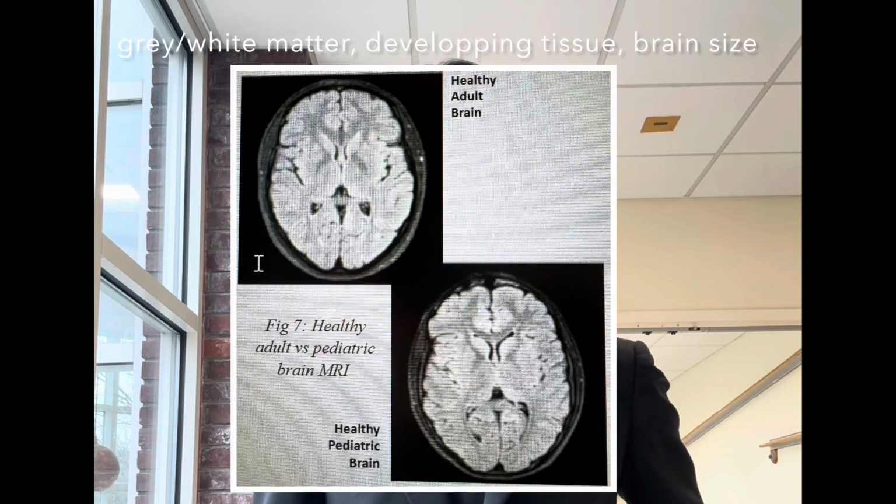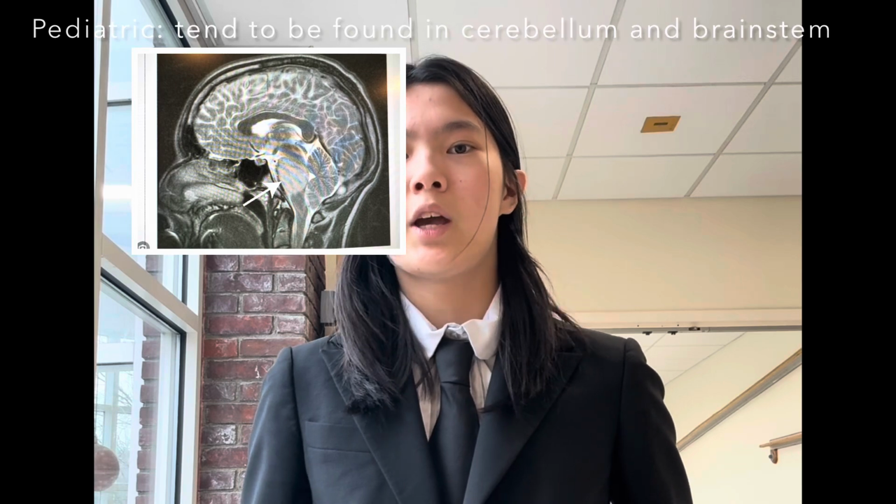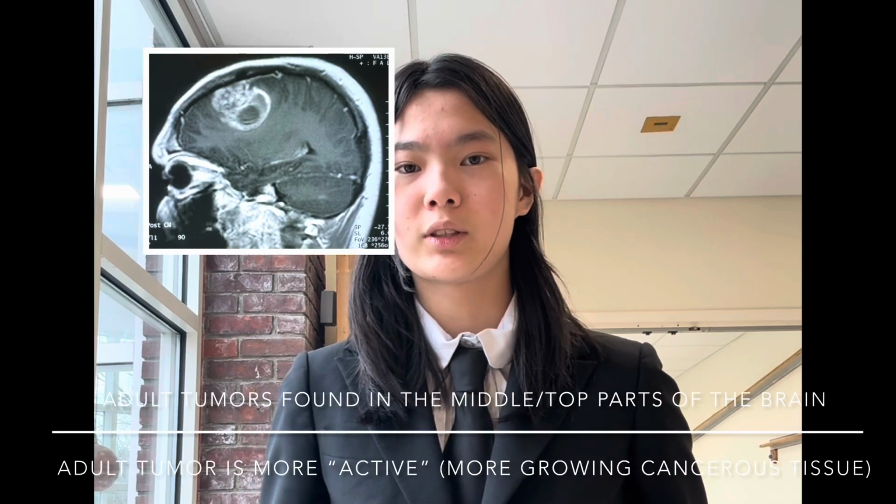Brain tumor segmentation is a highly researched topic, but many train their models solely on adult data. Not only do adult and pediatric brains have structural differences, tumors tend to be in different areas of the brain, and tumors tend to grow more aggressively in adults. These differences will require a separate pediatric data model.